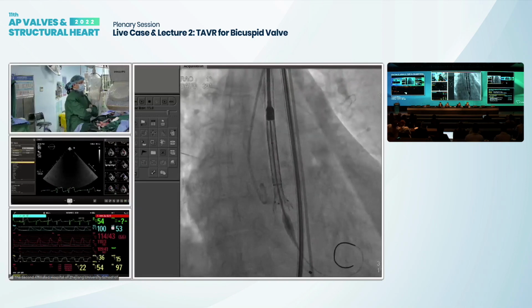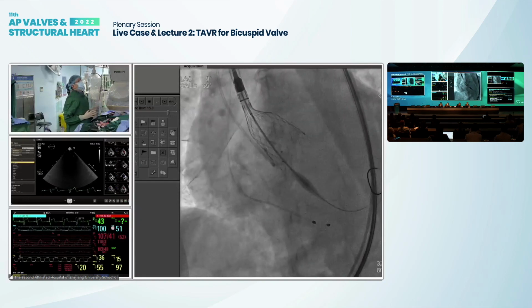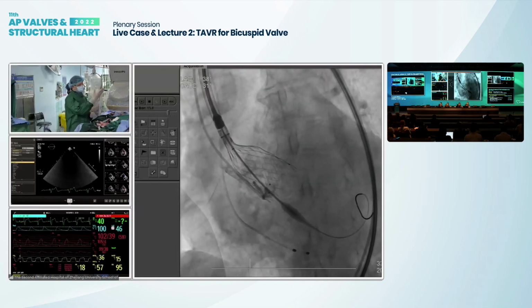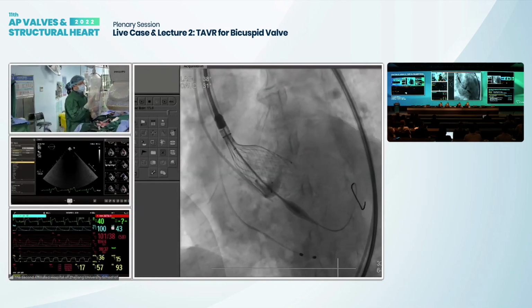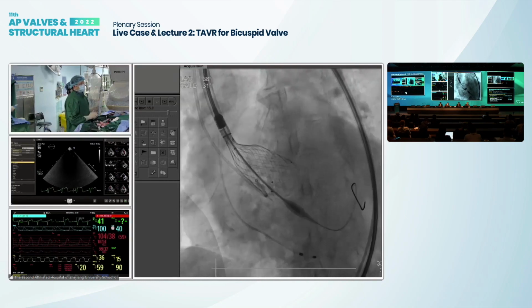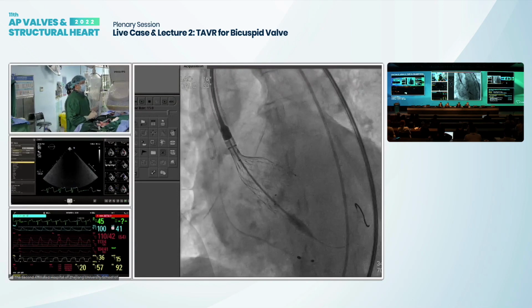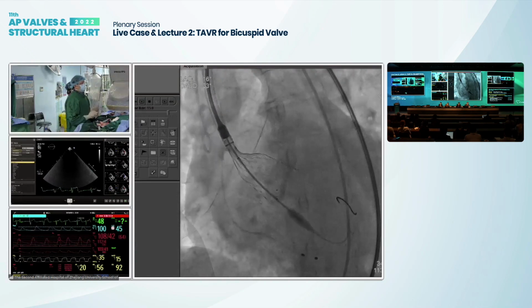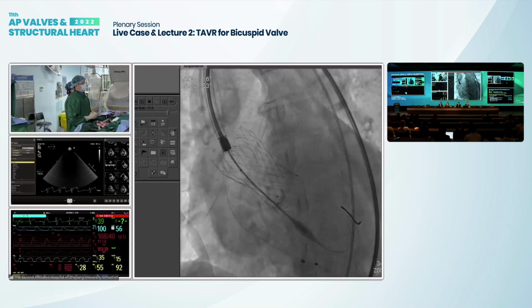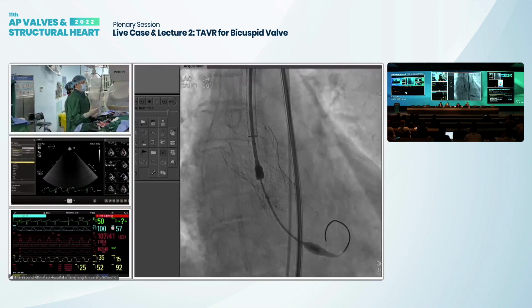It's very hard to have a very good projection, but we still tried. Now we release the device. We tried very hard to have a very good projection with a good alignment. But at last on this view, we have a very good alignment of three marks. Then we totally release, in this view. So keep on going, the final portion. Now it's releasing. We are close to, now we totally release it. Then we try to get the device out.